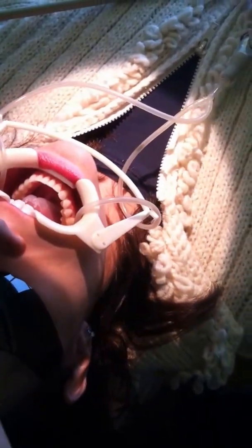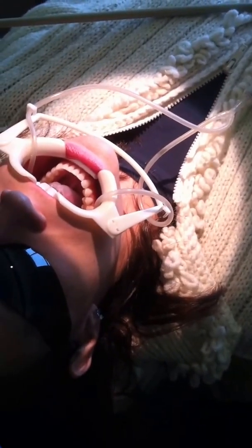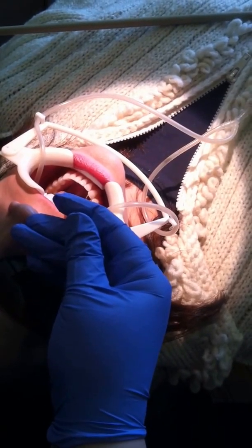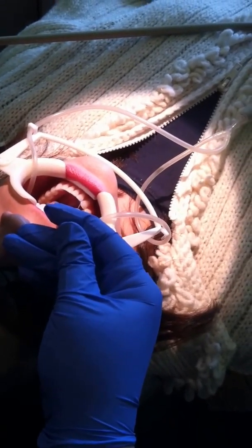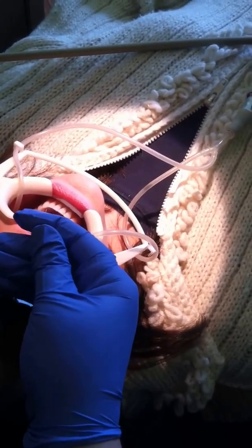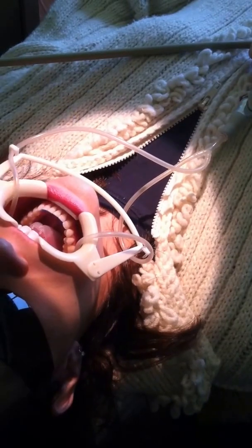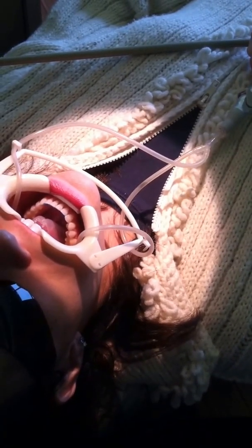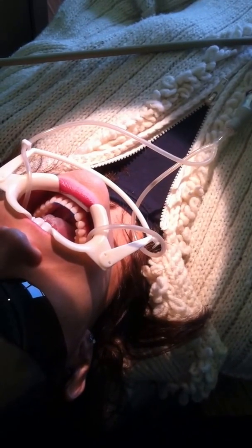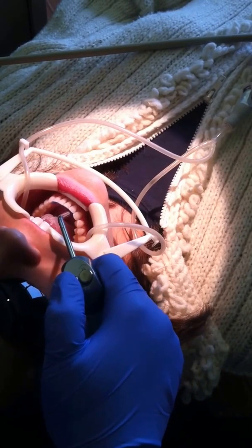Now we use a bonding procedure where we place 37% phosphoric acid etch on the lingual surfaces. We'll place all of the etch, and the etch stays in place for about 20 seconds. Then we rinse the etch — we've got another 5 to 10 seconds to go here.